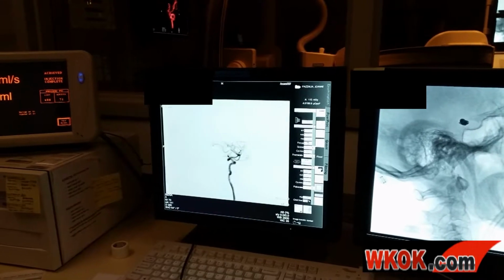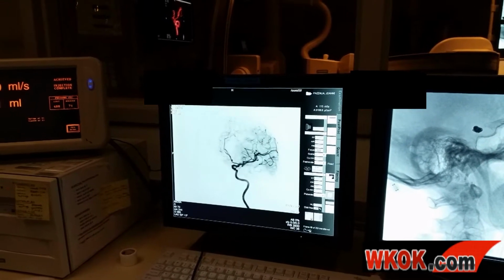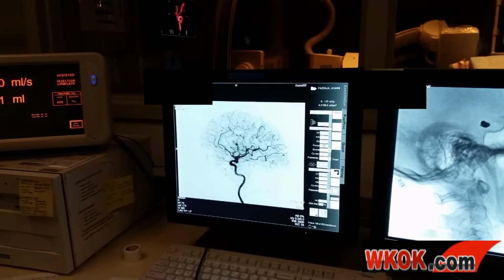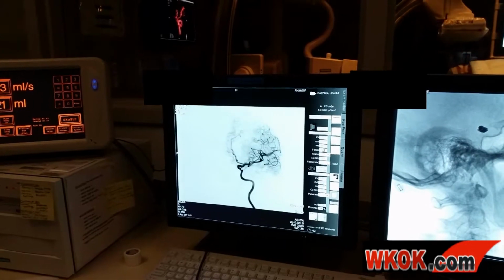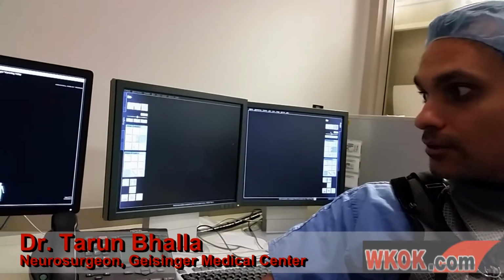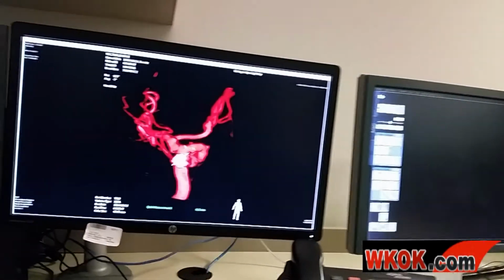One of the newest treatments is a pipeline embolization, or a pipeline stent. That's a mesh stent that's placed across the entry point of the aneurysm. It will eventually stop the blood flow going into the aneurysm. What we're basically going to do is take that stent and deliver it from the groin all the way up this artery, around the bend, and land the stent essentially across this opening in the aneurysm.